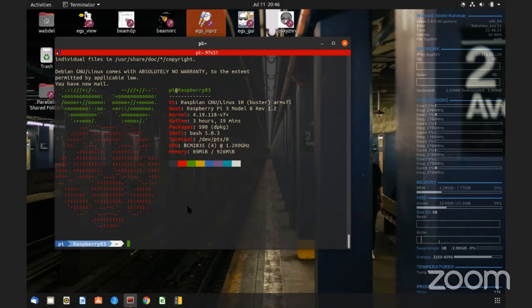It's like Open Directory, I think, in Windows, where you create a user on the server, and then all machines get the information from the server. So it's involved. I wrote the steps. They were specific to the Raspberry Pi, but with small modifications you can do it on machines running Ubuntu. No problem at all.